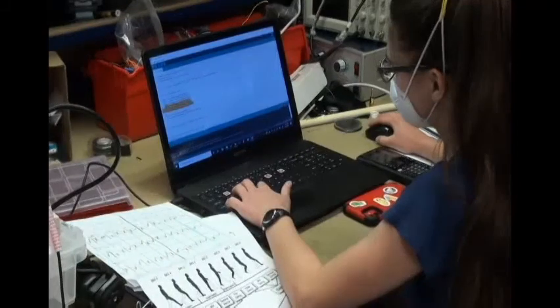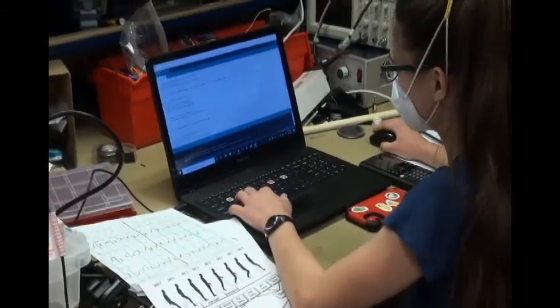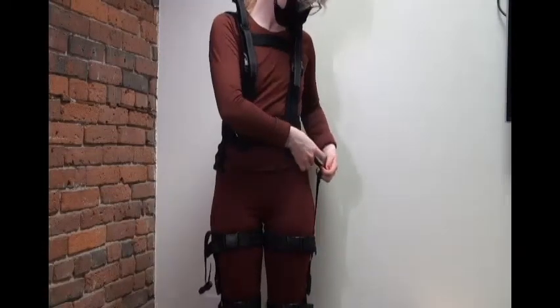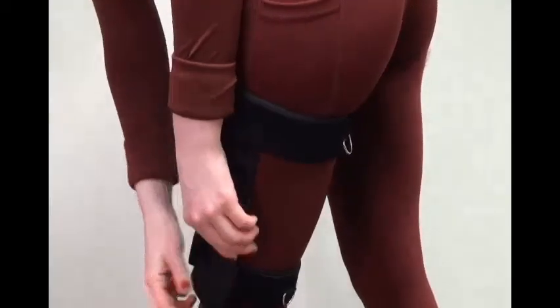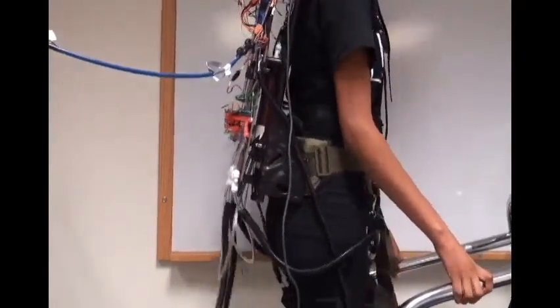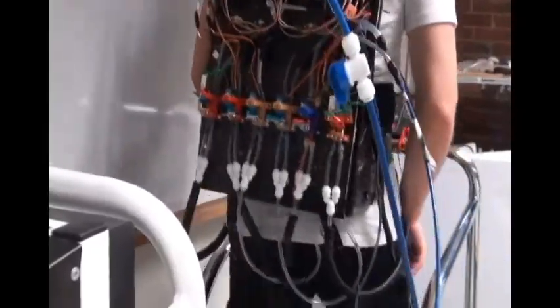For our major qualifying project, we propose the idea of an exo-muscular suit that utilizes the CRFC valve and hydra muscles. The exosuit is a wearable, modular, bio-inspired assistive device. We have placed hydra muscles in the approximate location of 3 muscle groups that are essential to the gait cycle, then actuate the hydra muscles using the CRFC valve.